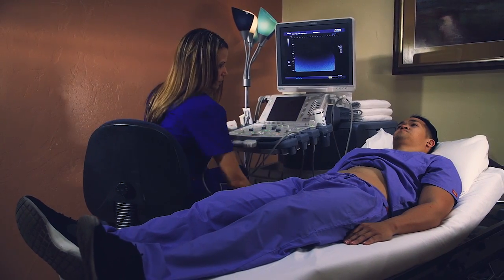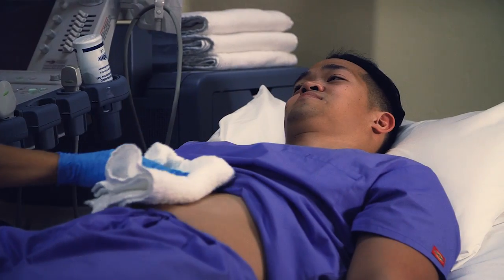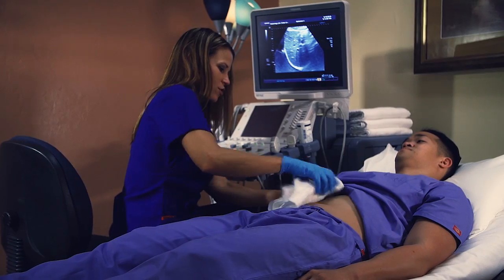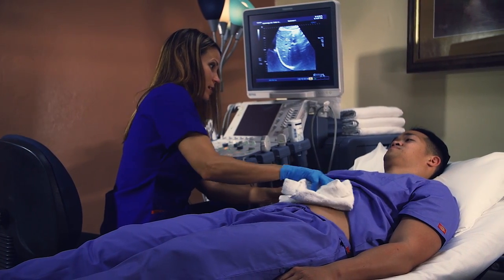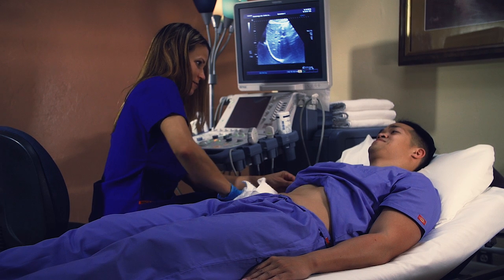Ultrasound can detect diseased or damaged tissues, locate abnormal growths, and identify a wide variety of conditions, enabling your radiologist to make a quick and accurate diagnosis. Ionizing radiation is not used in ultrasound, making it a safe alternative for imaging pregnant women.